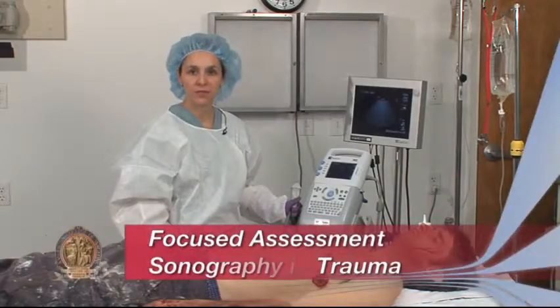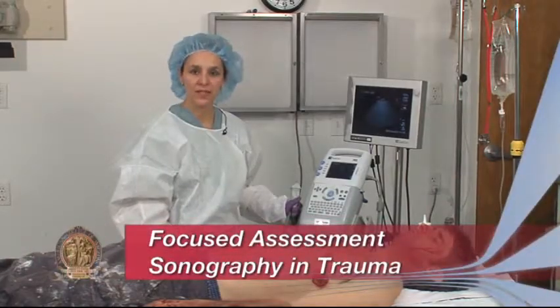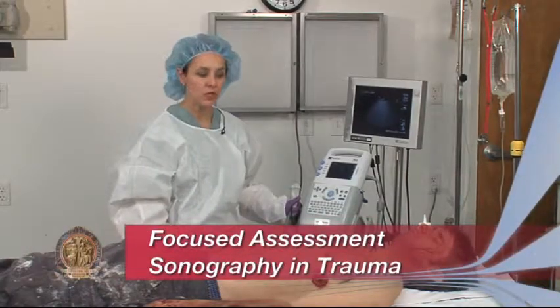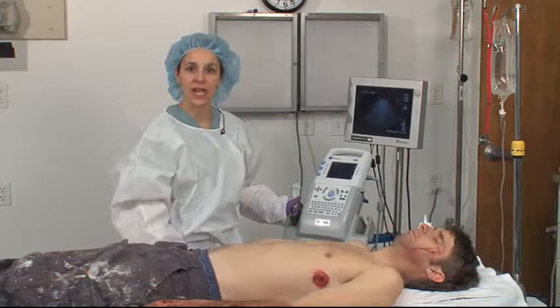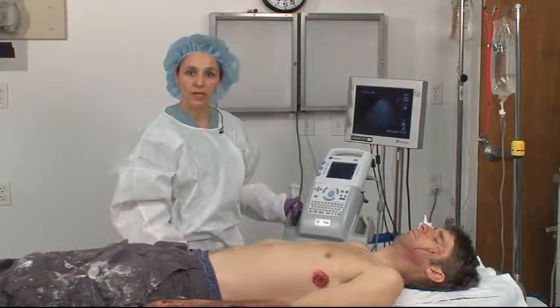The Focused Abdominal Sonogram for Trauma, the FAST Exam, is used to look at specific locations in the abdomen for blood.